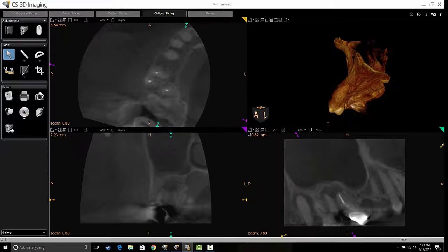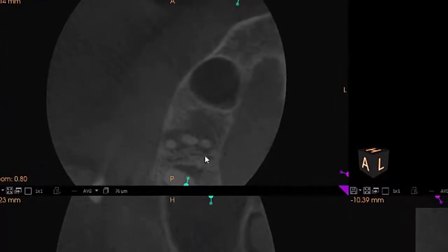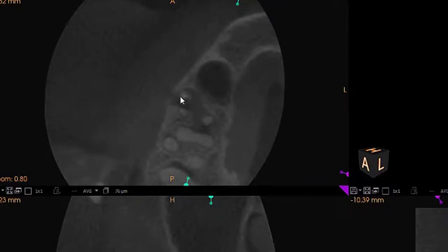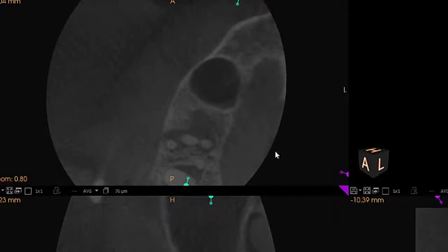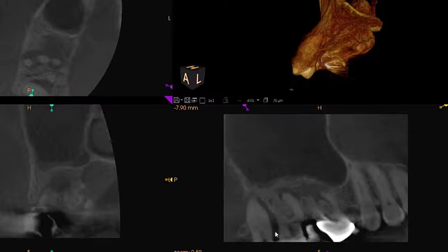Coming back up to the axial slice, I want to point out that this is a four-rooted upper second molar — one, two, three, four — with one root fused and basically separating right at the apex. The area of apical periodontitis appears to be continuous from the mesial buccal to the palatal root of tooth number three, extending to the mesial of tooth number two. As I move apically a little more, we can see it continues around all three roots of tooth number two — it's quite a big area. I'm also noting significant bone loss on the mesial aspect of tooth number one, where that 10-millimeter pocket is.